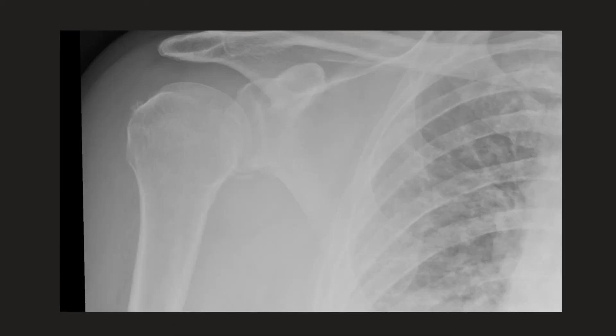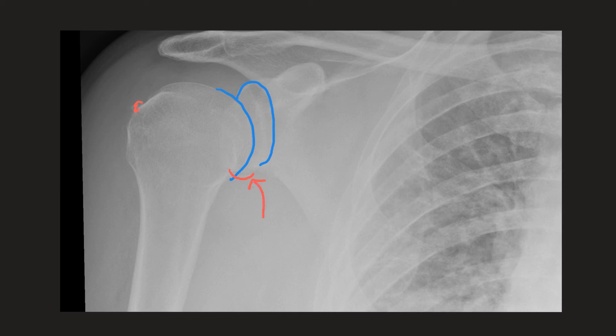Looking at this x-ray there's no current dislocation, as the humeral head is nicely congruent with the glenoid. However, looking more closely, you can see a bony fragment inferior to the glenoid — a bony Bankart lesion — and a bony fragment in the posterolateral humeral head, in keeping with a Hill-Sachs lesion. This patient must have had a previous anterior dislocation which caused these injuries.